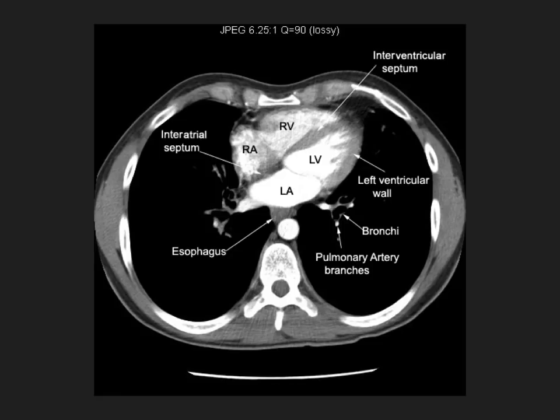Again we see the mediastinum with the heart and the different chambers. One thing I want to draw your attention to is that the esophagus sits right near the aorta. The aorta is much more circular, whereas the esophagus is slightly smaller and a little bit more irregular in shape. That's high yield because oftentimes they'll show you a CT and want you to pick out the esophagus, the aorta, or the inferior vena cava. So you really want to be able to decipher between esophagus, vena cava, and aorta.